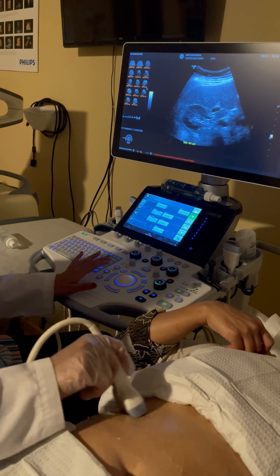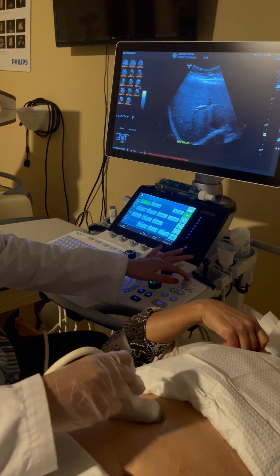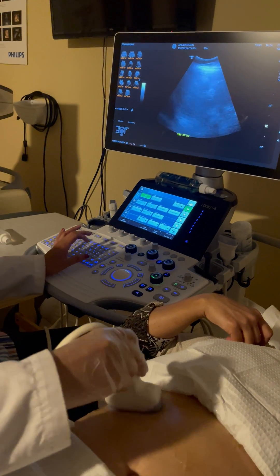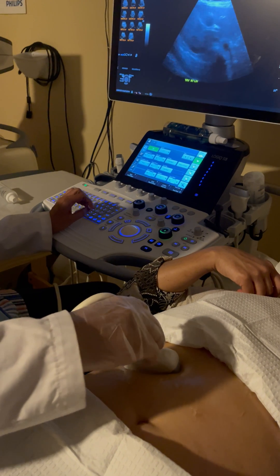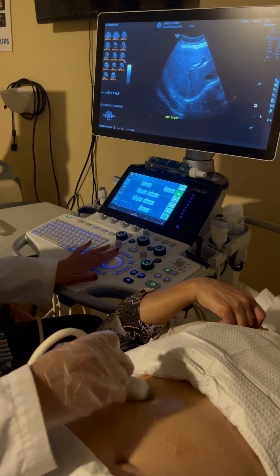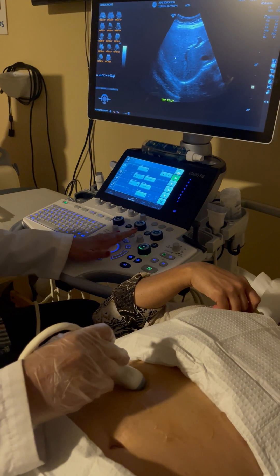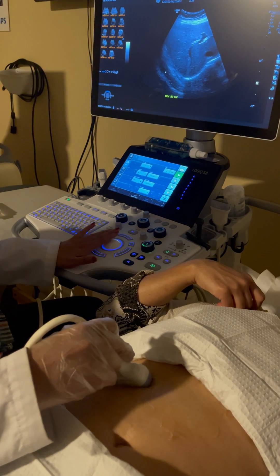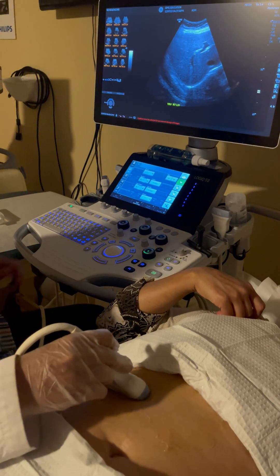The last image of the liver is the pleural space. I increase depth, optimize the TGC, place the transducer oblique and parallel to the ribcage, and rock the transducer to get the pleural space. This shows the dome of the diaphragm with the right lobe and the adjacent pleural space, to look for any pleural effusions or fluid collections. This concludes the entire liver protocol.